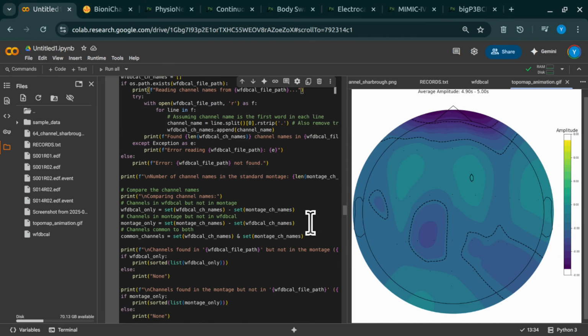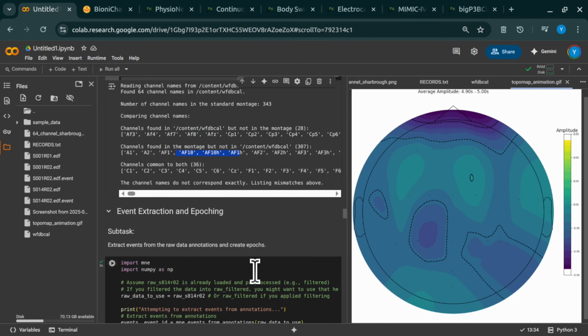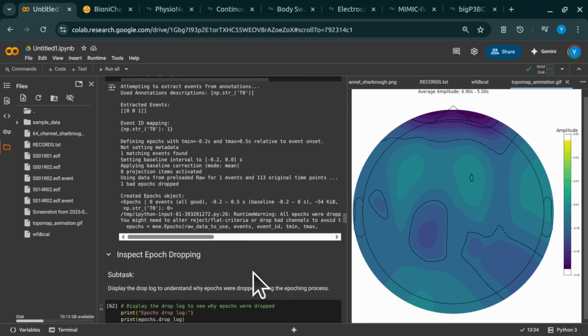Man, that sounds incredibly frustrating. Fixing one thing, then another pops up. What was the breakthrough? How did you finally get an epoch? It was a mix of frustration and determination. The detective mode kicks in. The breakthrough was a bit of a compromise, really. We decided to temporarily remove the reject parameter altogether.